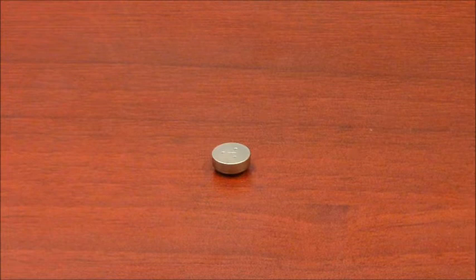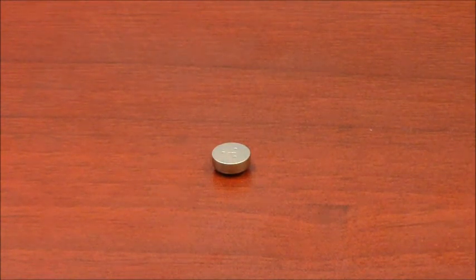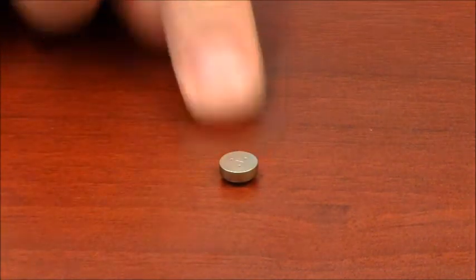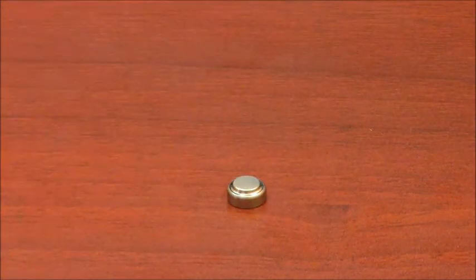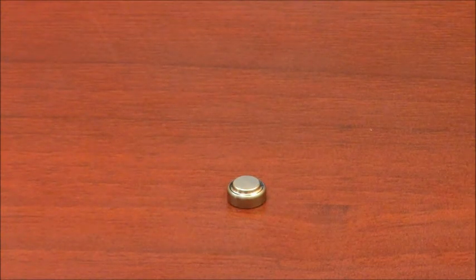to realize the landmarks on a hearing aid battery to make sure you have the battery in the correct orientation. So one side of the battery you can see will be flat, and if we turn it around, the other side of the battery will sort of be ridged. These two landmarks will be really important when we talk about the correct orientation for inserting your battery.